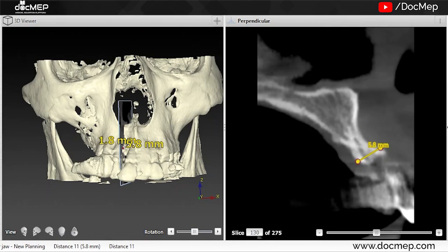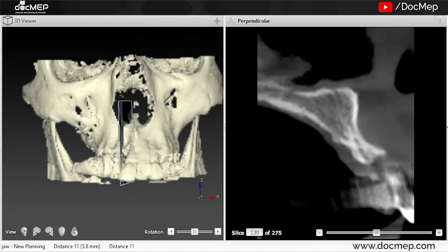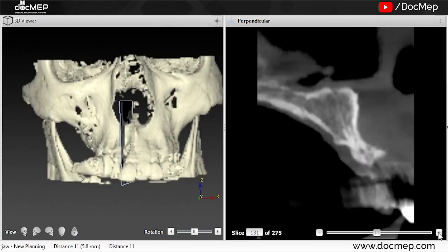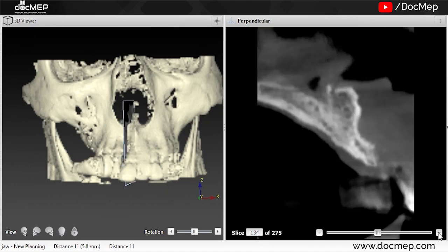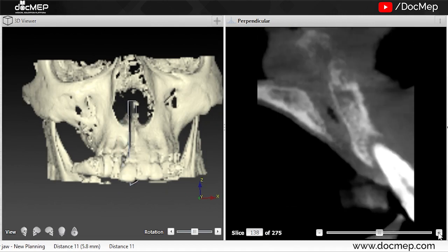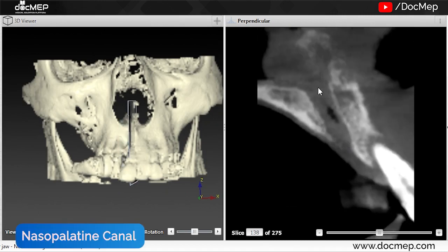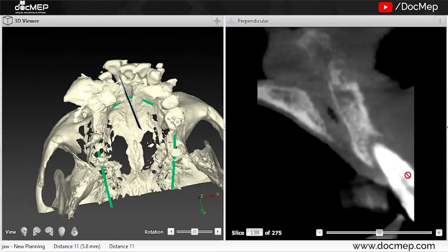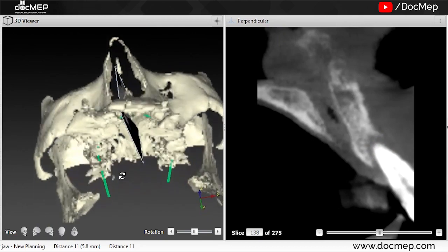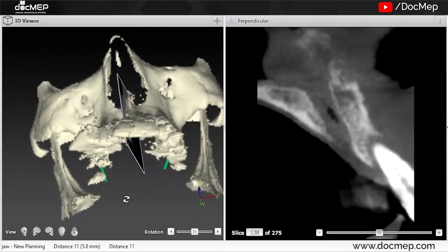Let us check the left side of the same patient. As I approach towards the center, this is the nasopalatine canal region. This tooth is almost out of the socket — almost there is no bone at all. This is easy to communicate with the patient; they understand better.